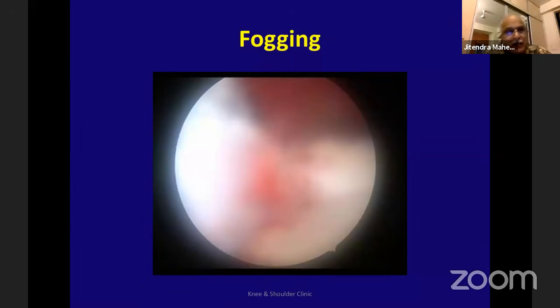Unless you have seen the whole notch in one panoramic view, you have not removed enough fat pad, and you will struggle. Once you have removed the 12 o'clock fat pad, as I showed you, as soon as water comes in, you can see the whole notch in one view. If you can see that, enough fat pad has been removed. Except in ACL surgery, where we have to flex more and remove more fat pad, in other surgeries you don't need to remove any other fat pad. Just detach it from the 12 o'clock position, and with water pressure, everything becomes visible.